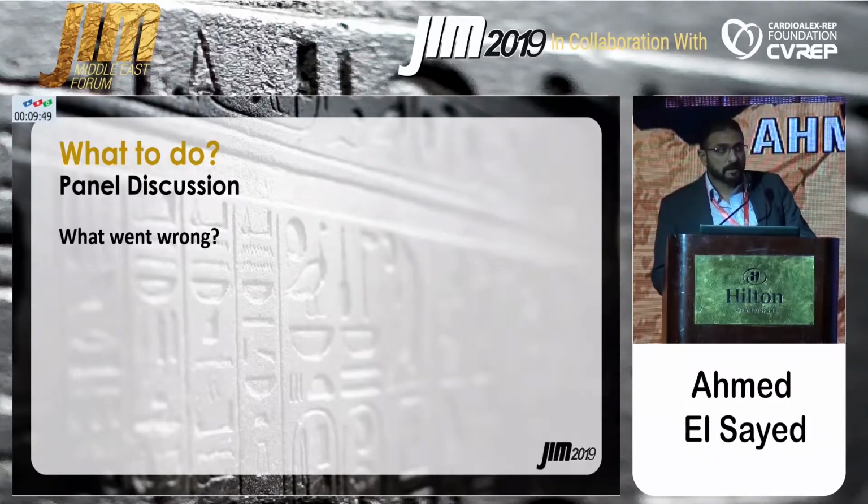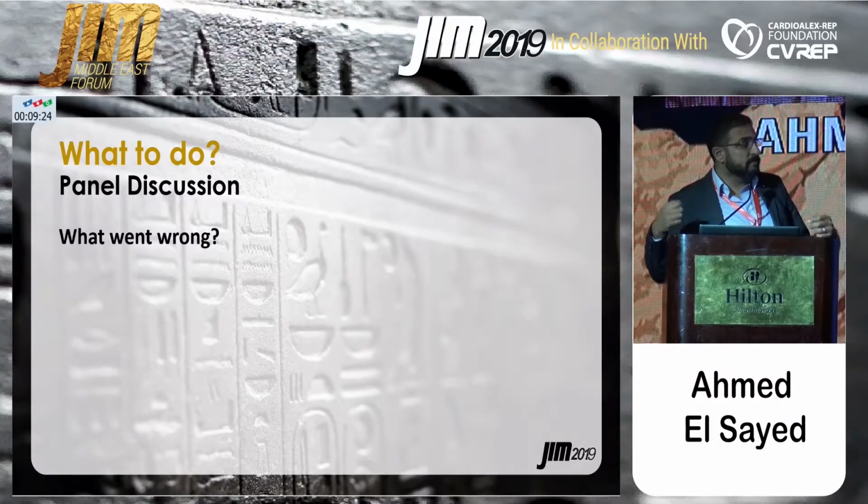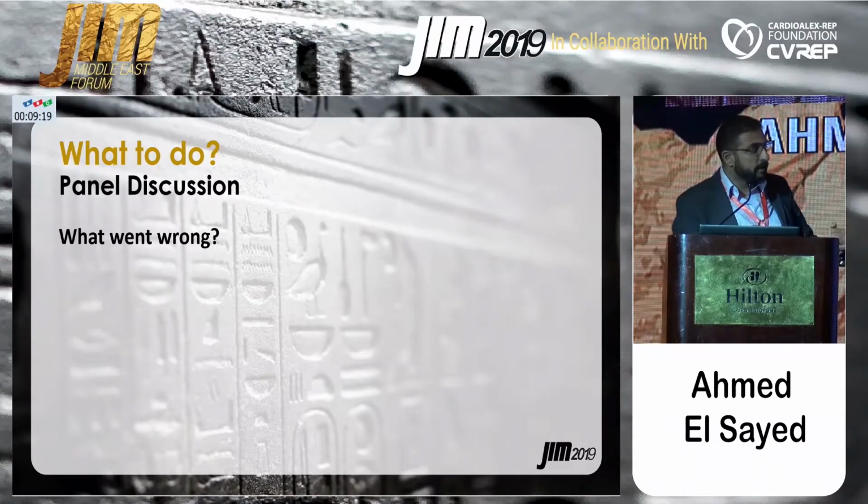It could be induced by the wire itself in the left ventricle. But we didn't inflate it yet. The patient arrested before inflating the balloon. So while they were doing resuscitation, I went with the balloon inside and inflated it while they were resuscitating the patient. But the patient had already arrested before the balloon inflation.